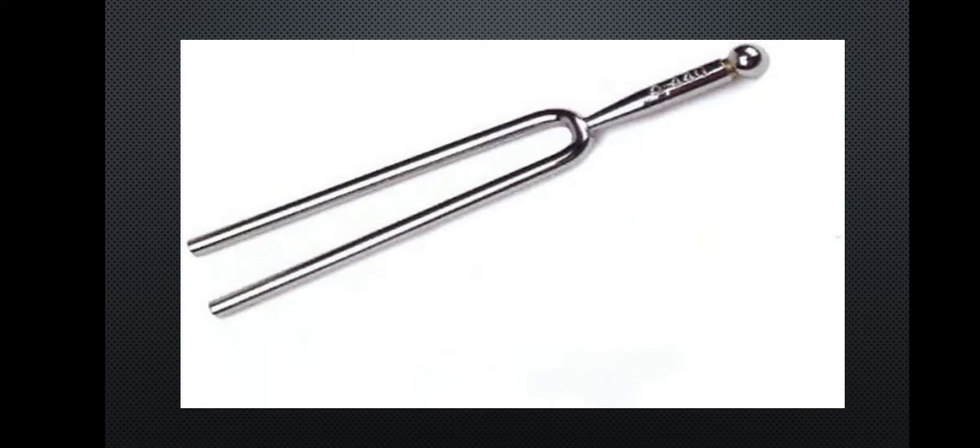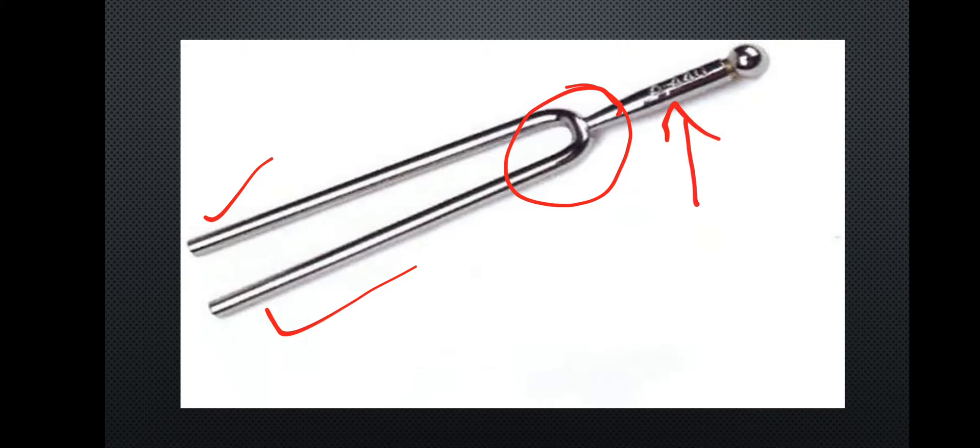Here are three parts of the tuning fork: two prongs, one shoulder, one stem, and one base.